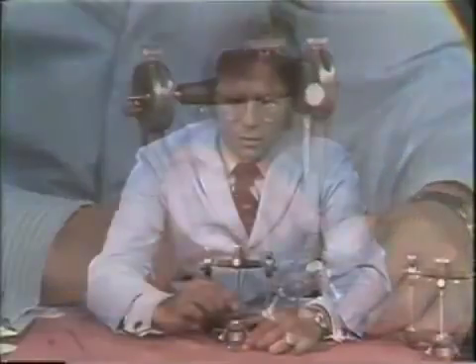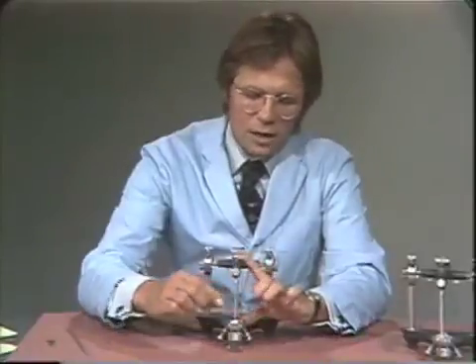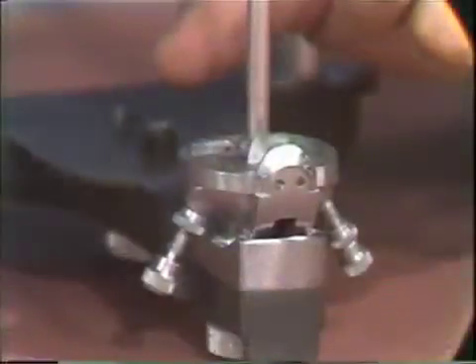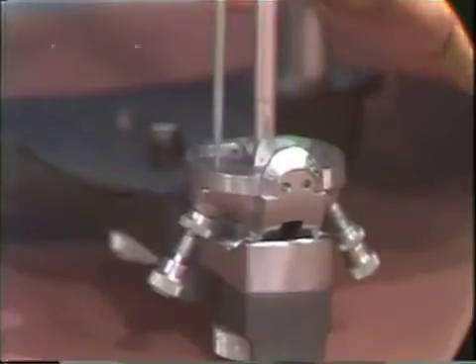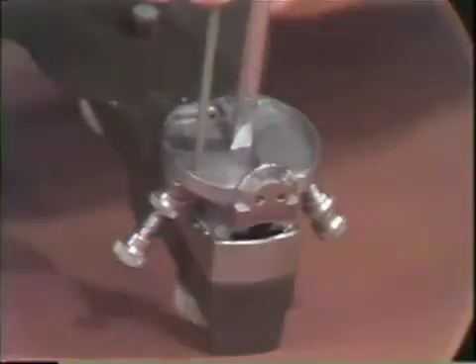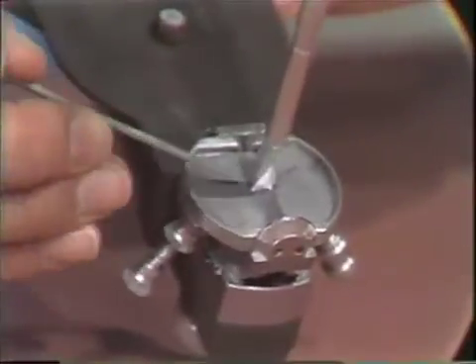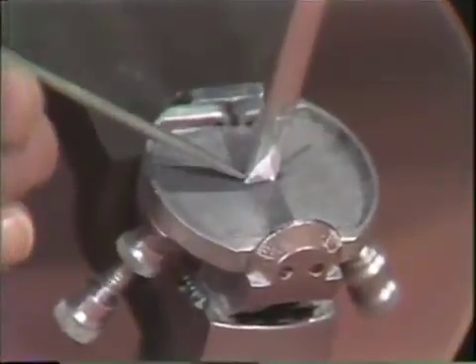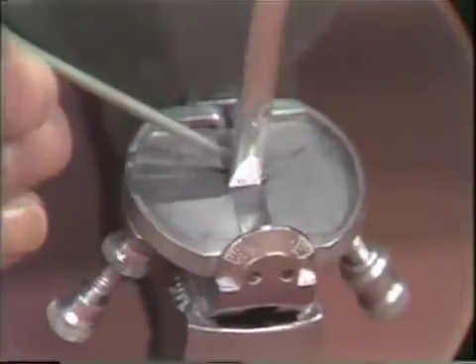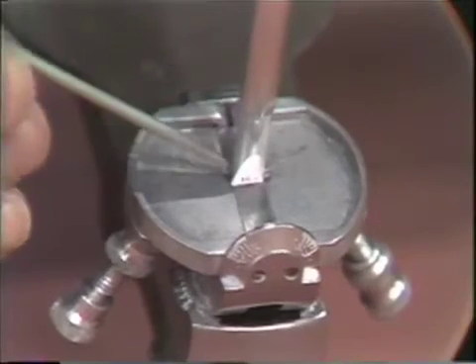With the upper member of the articulator pulled forward, arced, and brought down to touch the incisal guide table, the incisal pin should be perpendicular to the table. The pin should bisect the antero-posterior dimension of the table and be in the very center of the table, with the blade of the incisal pin running along the center groove of the table.